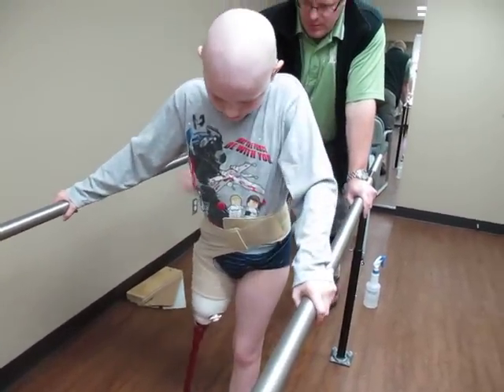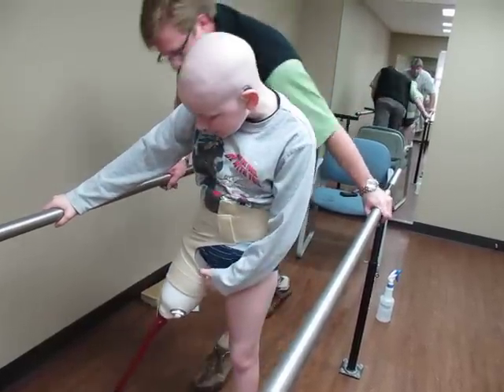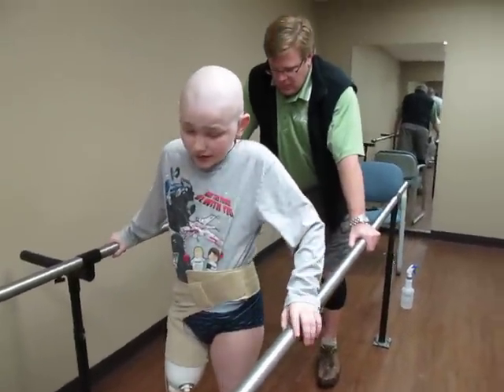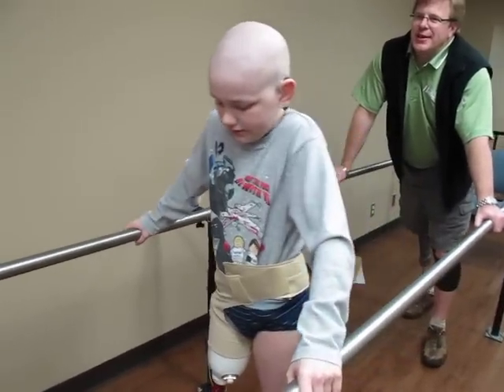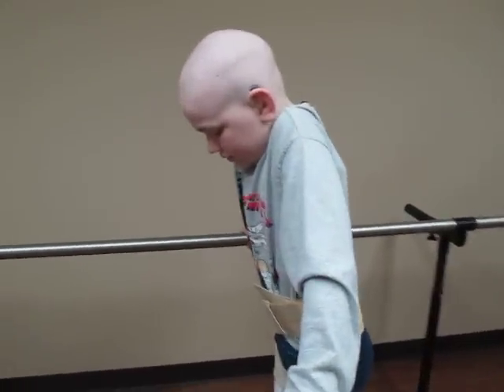Ow. Where'd it hurt? You said ow — where's it hurting? Right there. Okay. The socket's over a little bit too far. We'll just wait. Everything's perfect right now. I'm pushy. No, that's fine. I understand. We can. I'm pushy — that's what I do. You're doing great, T.